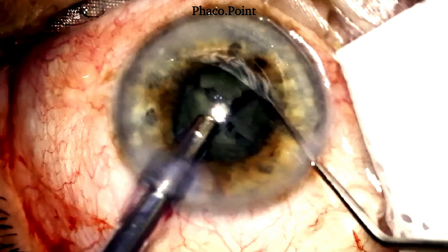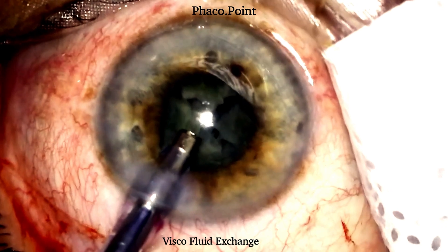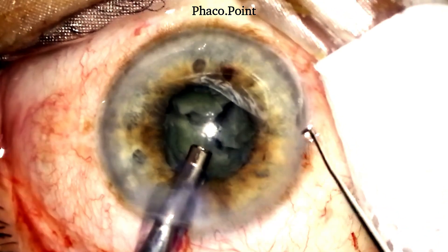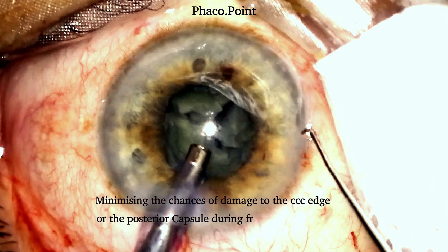Watch how the entire nucleus disassembly takes place within the central visible part of the nucleus itself. Performing a viscofluid exchange intermittently is a great idea, as putting some viscoelastic into the anterior chamber enhances protection of the corneal endothelium. Now that nucleus disassembly is complete, we no longer need a chopper. The second instrument is replaced with a Szynski hook, which makes nucleus emulsification safer by preventing accidental damage to the posterior capsule with the sharp chopper edge.